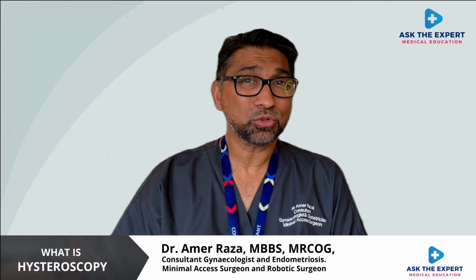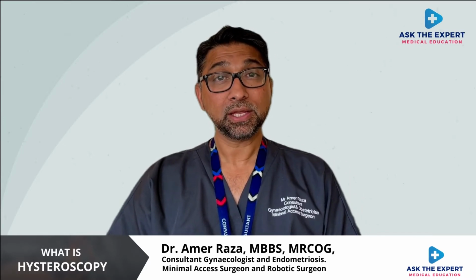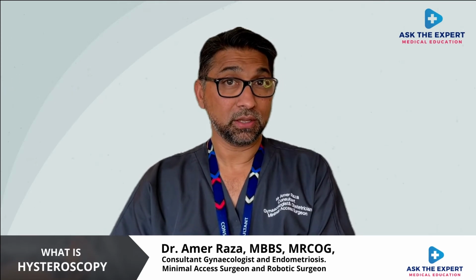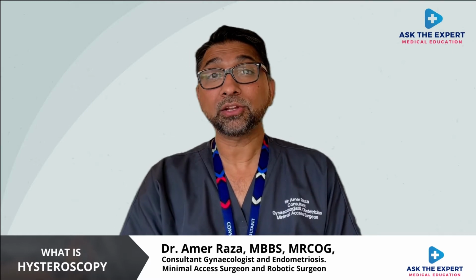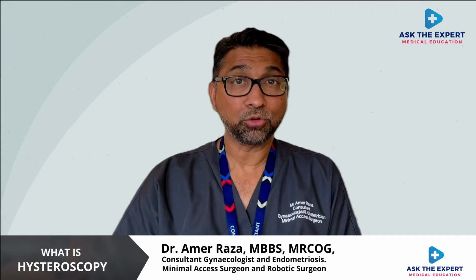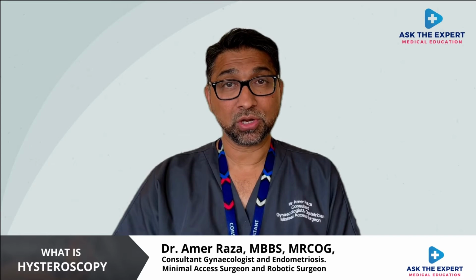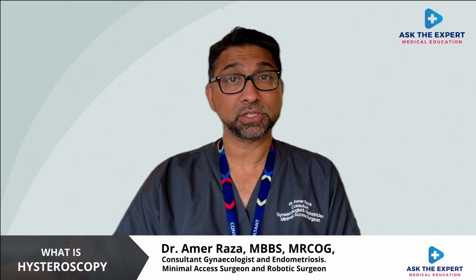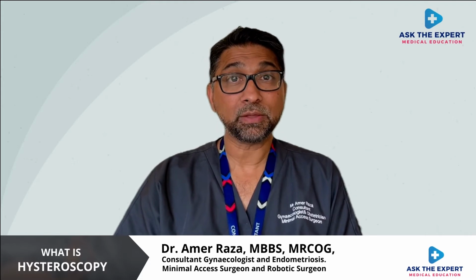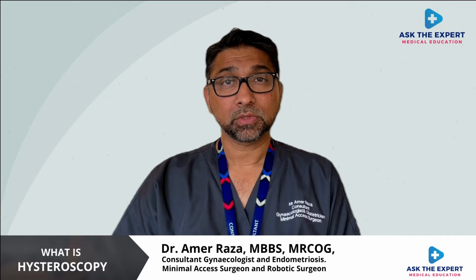I can divide the hysteroscopic technique into two main techniques. One is hysteroscopy under local anesthesia in an outpatient setting, or to have a hysteroscopy under general anesthesia in an inpatient setting. We will now talk about outpatient hysteroscopy. Outpatient hysteroscopy is a very common procedure and carried out almost in all hospitals now. It has the benefit of walking into a clinic, having the procedure done, and going home after a few minutes.